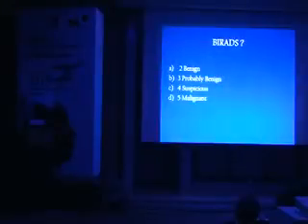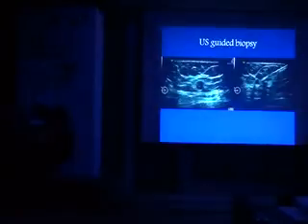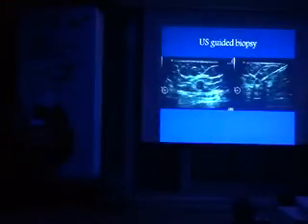Ultrasound, right? Noran is laughing. But anyhow, before we do an ultrasound, we just answer this: is it benign, probably benign, suspicious or malignant? I'm sure all of you would go for BI-RADS 4, right? Okay, good. Now comes the second challenge. How can we take a biopsy from a 3 millimeter lesion? Yes, we can. And that's how it was done.